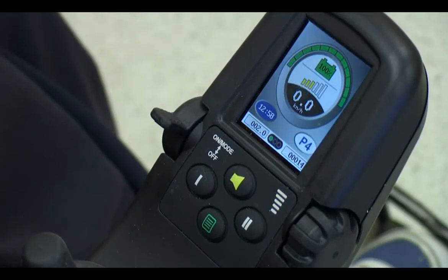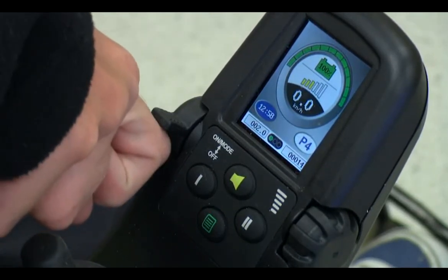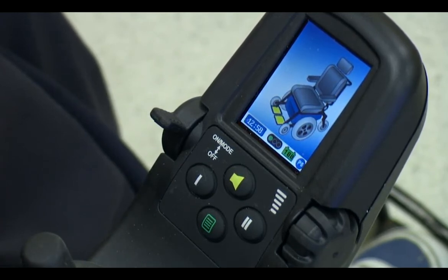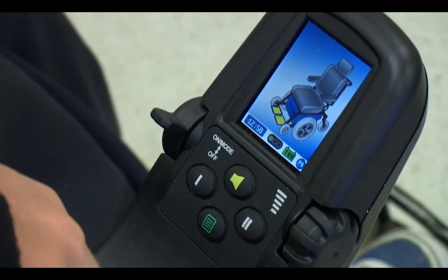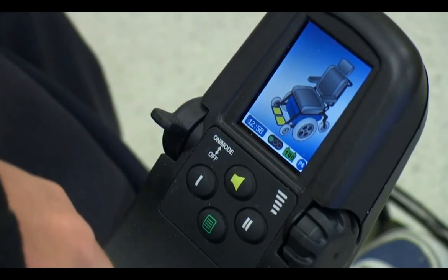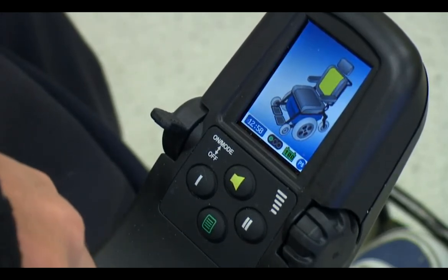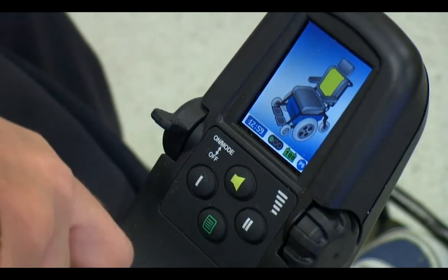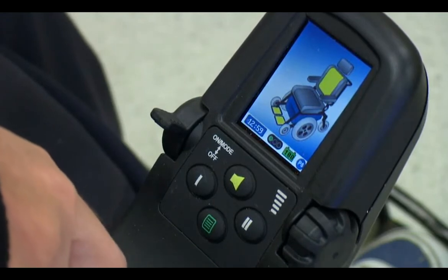And then I'll go up again, and this is where you can do all your footplate and backrest and arm-powered tilt. To switch between them, just move the knob left or right, and you can change. So now I can lift.